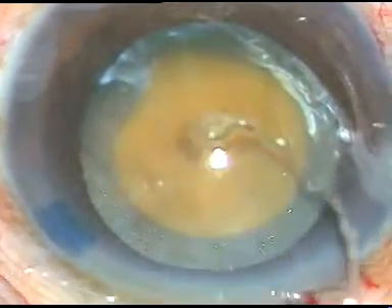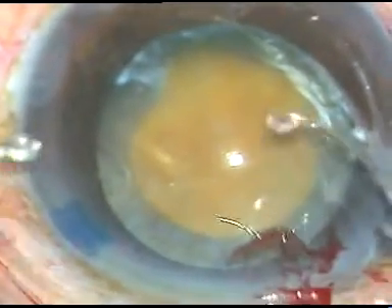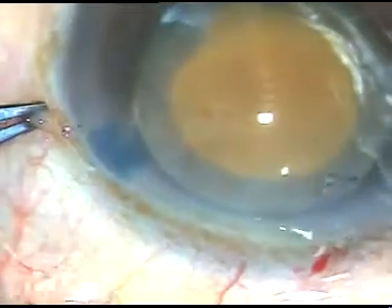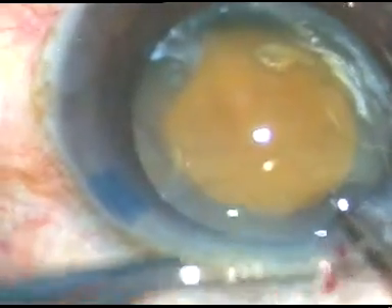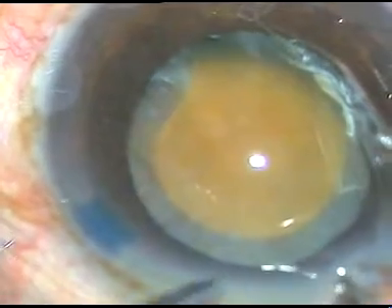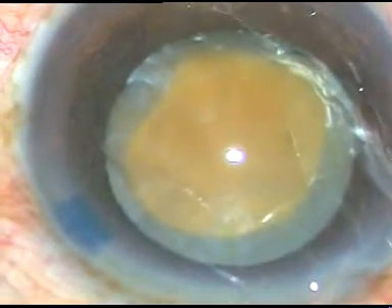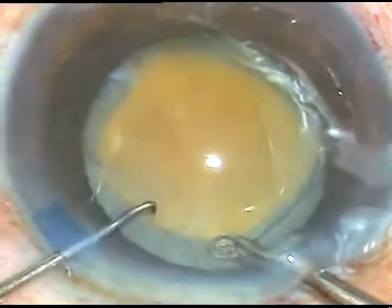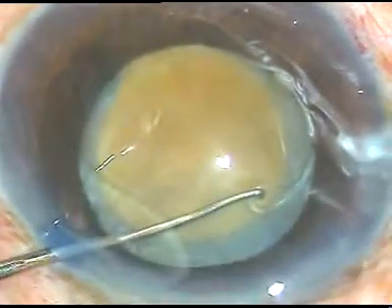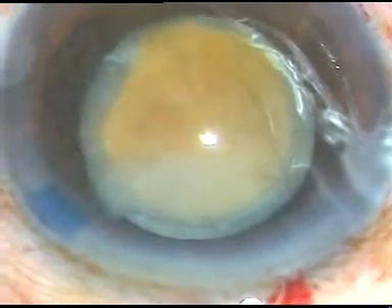The zonule may be weak, so a capsular tension ring (CTR) is being placed to support the capsular bag. The leading end goes into the capsular bag. The CTR is gradually pushed into the bag. When the trailing end comes, I hold very close to the trailing eyelet, take a Szynski hook, introduce the prong into the eyelet, and gently place it in the equatorial region of the capsular bag. The CTR has been placed in the capsular bag.